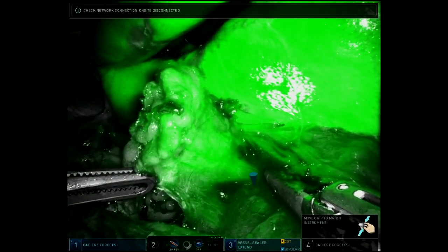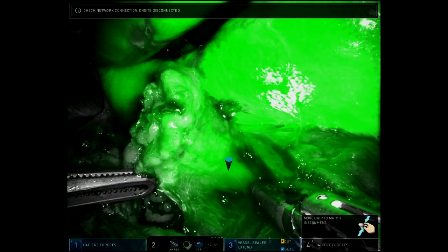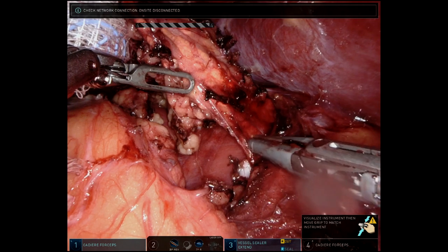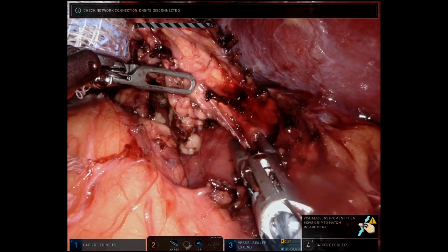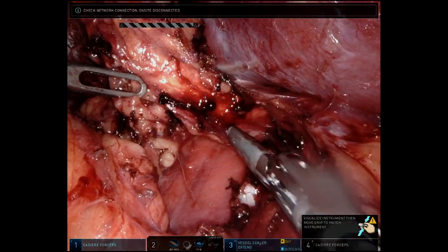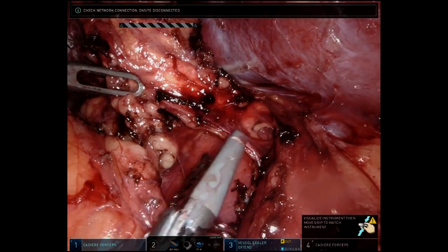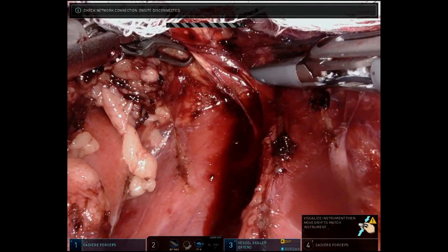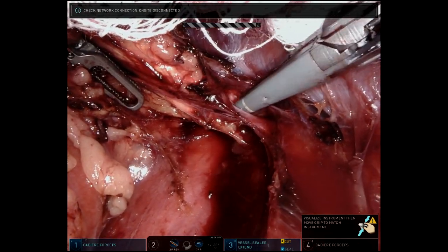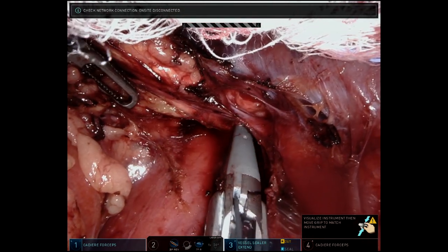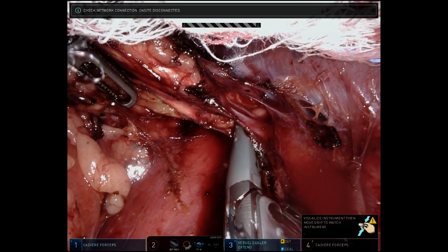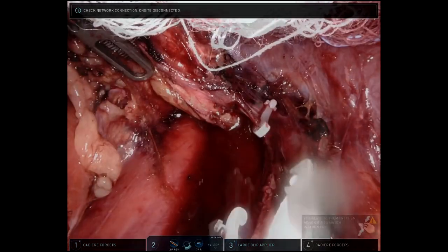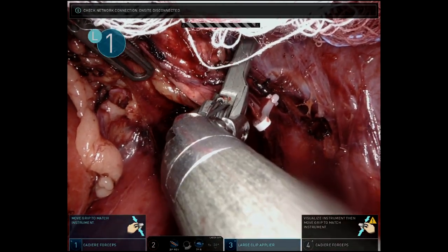The adrenal vein is now identifiable with Firefly. This allows for careful dissection of the retroperitoneal fat at the medial aspect of the gland until the adrenal vein is visualized directly. The vein is then circumferentially dissected with the vessel sealer, clipped, and subsequently divided. Note the benefit of the wristed instruments to gain appropriate angles for clipping and dividing the vein.